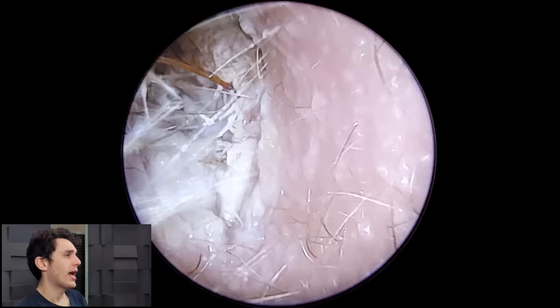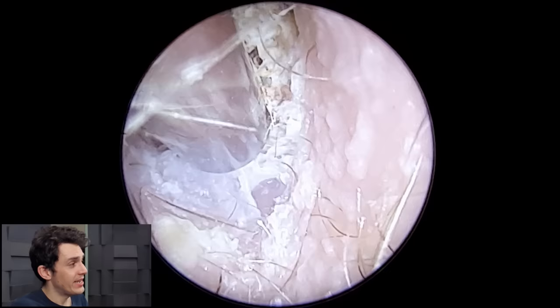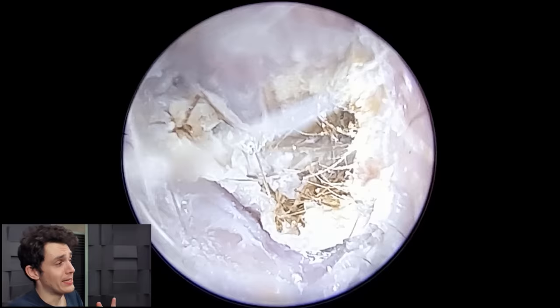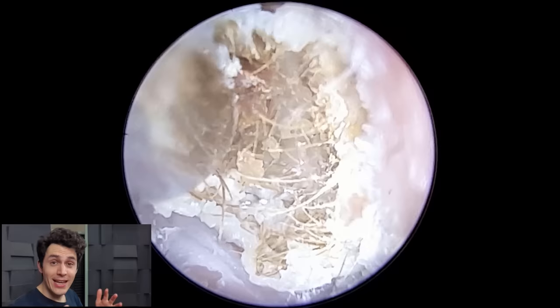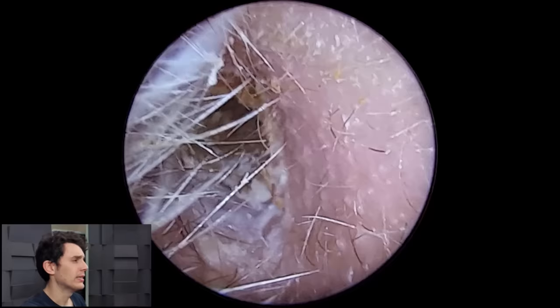On entering the ear canal with the endoscope, we can see this whitish debris — dead skin, sheaths and flaky bits of dead skin in the ear canal. That's all perfectly normal; we see it all the time and it's fairly easy to get out with suction or crocodile forceps. But what makes this case particularly unusual is, first of all, the amount in the ear, and secondly the density of it — it's highly compressed.